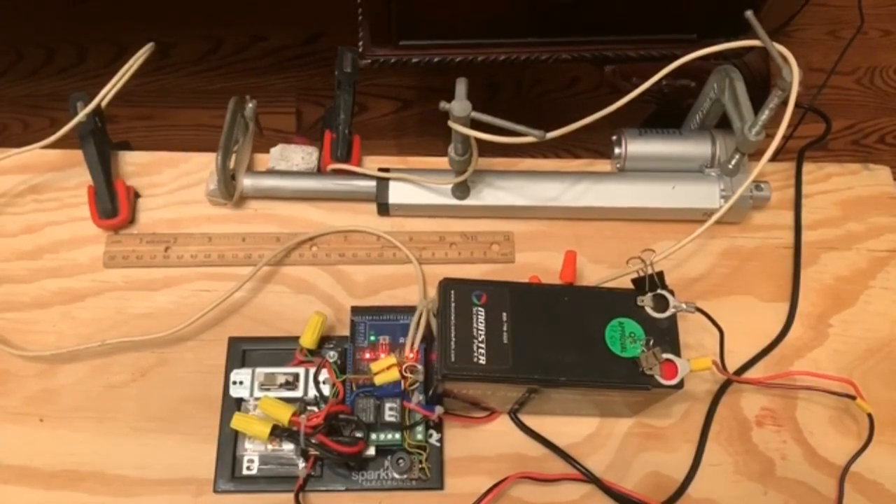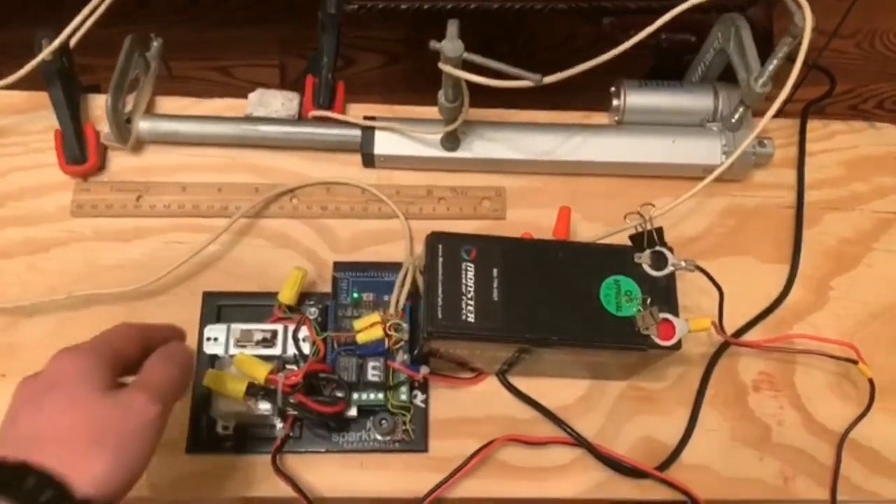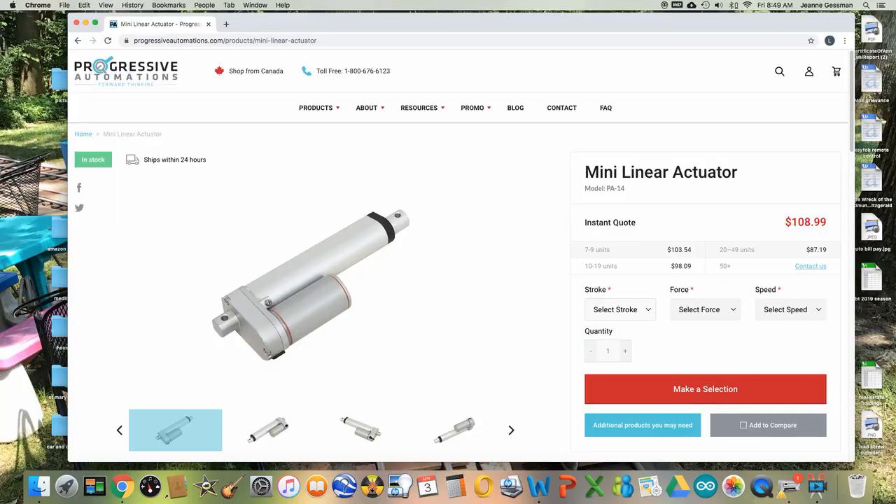The respiratory rate is controlled by a potentiometer on the board. The advantage of this actuator is that it uses a brushless motor which is rated for continuous use. Most actuators use brushed motors with 20% or less than 50% duty cycle and can burn out under continuous use. The disadvantage is that it is a bit too slow at two inches per second, so another actuator should be found.